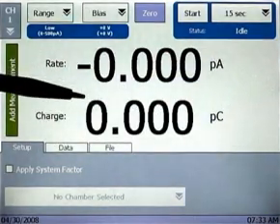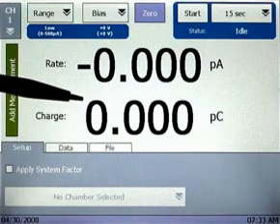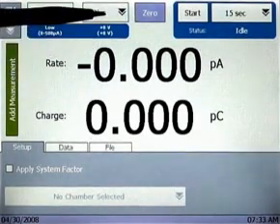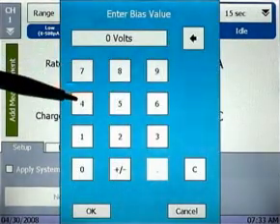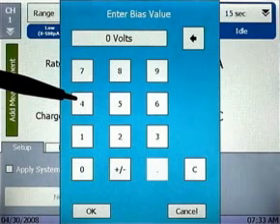Now that we have the range selected, let's choose a bias setting. To select the bias, tap the bias pull-down menu and then tap Select Bias. A keypad appears allowing entry of any value of voltage level, plus or minus, from 100 up to 1000 volts in 1 volt increments. For this example, let's enter negative 500 volts.